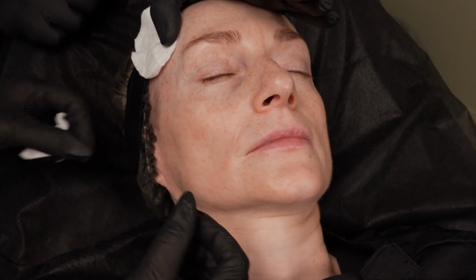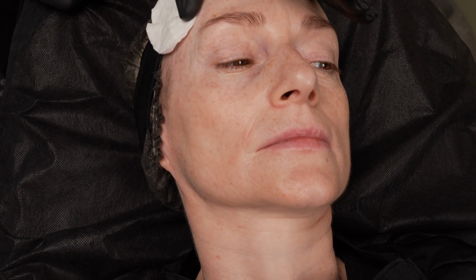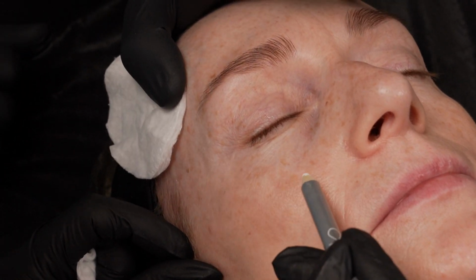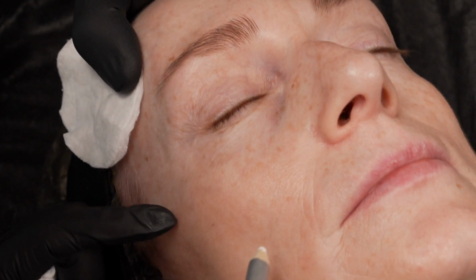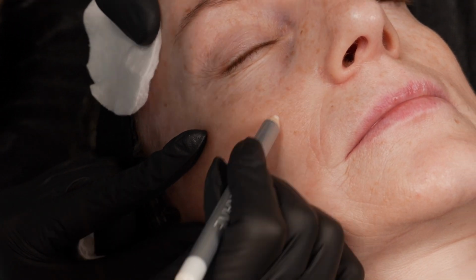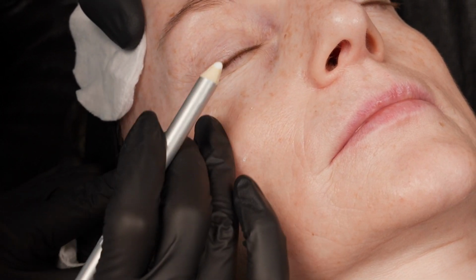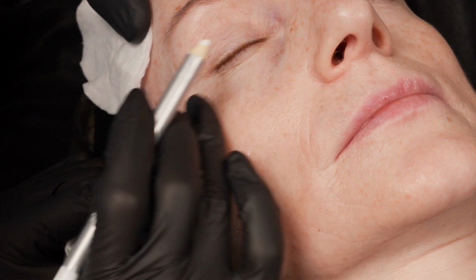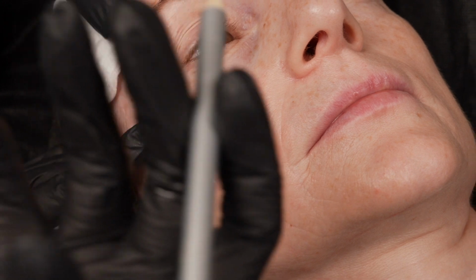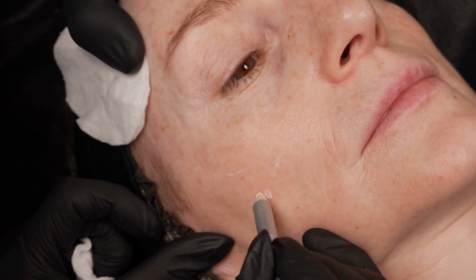Точка вкола, получается. Где бы я сделала, да? Если я хочу проработать именно зону средней трети лица, получается, да? Я бы сделала вот здесь вкол и вот так. Сюда бы меньше, сюда бы я практически не ложила препарат, потому что здесь малярный мешок, он потом начнет отекать, я так предполагаю. И проработала бы зону именно латерального лифтинга.